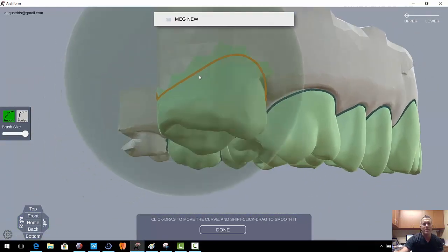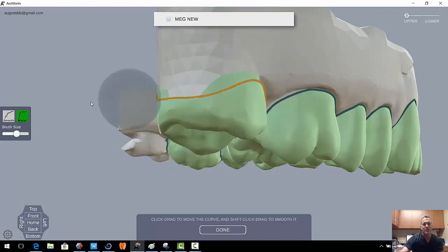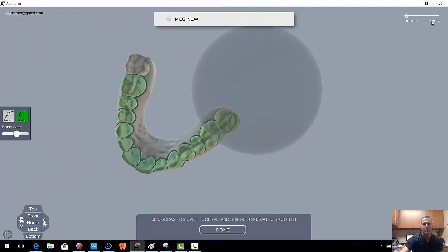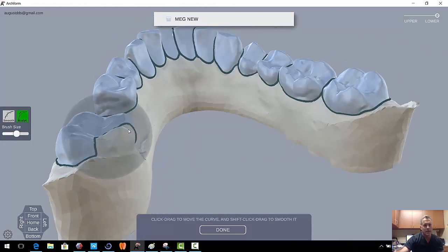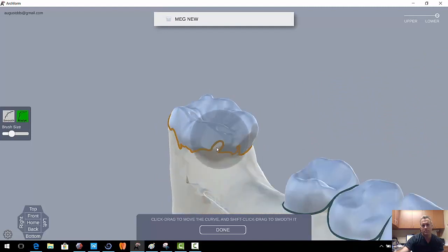So this is now looking a little bit better. You can see that this is extended down here, so we can pull that stuff down. Pull it back on the actual tooth itself. And we can use the smooth function again and smooth that down and sculpt it. Okay, so now we're done isolating the teeth. Let's check the lower. Looks pretty good except for here on the molar. So I'm going to move that and work on grabbing, and then we'll just smooth out these borders.